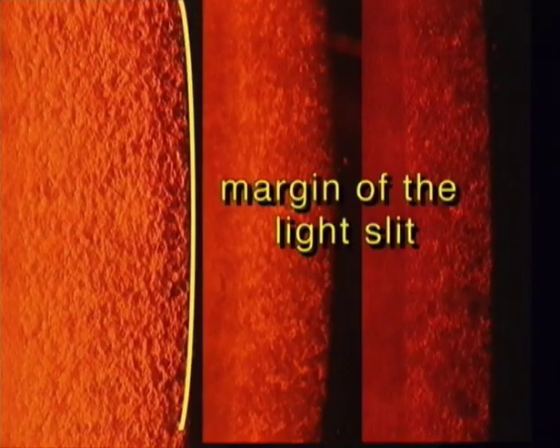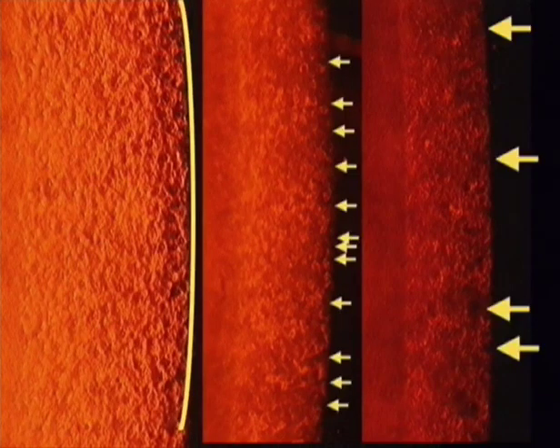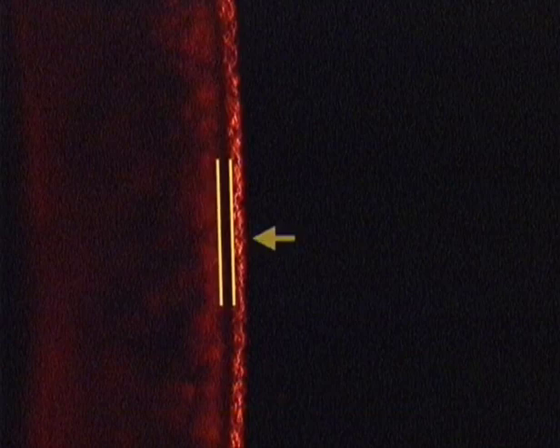Note also the margin of the light slit, the regularity or irregularity of which represents the regularity or irregularity of the epithelial surface. Furthermore, in the same eye and in the same area, when we change the incidence of light, the number of reflecting spots may vary. In this normal cornea, the optical section shows the epithelium as a homogeneous transparent strip between the superficial reflex and the irregular pattern of the stroma.